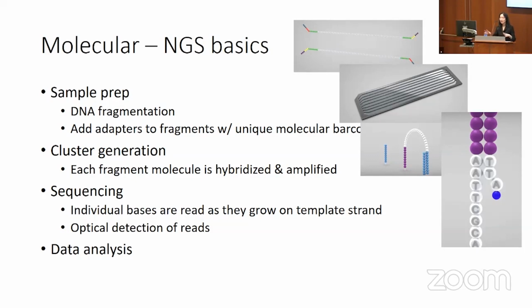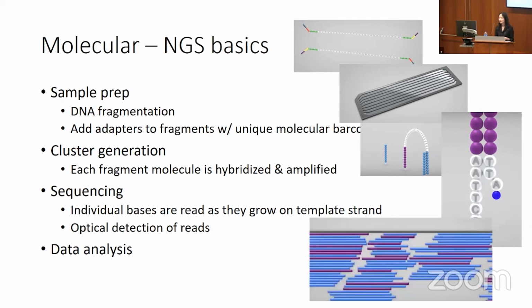So many patients' samples can be loaded at the same time, but somehow it gets sorted out because of these unique molecular barcodes. Then the data analysis happens. All these fragments get lined up together to reduce error, and it gets aligned to a reference strand. And this is probably the hardest part, where data scientists look at which section is abnormal and how much of it is abnormal. And this gives you the NGS result.